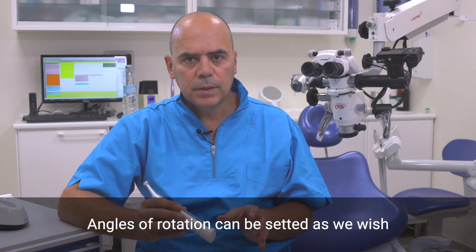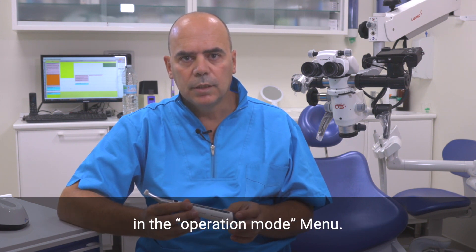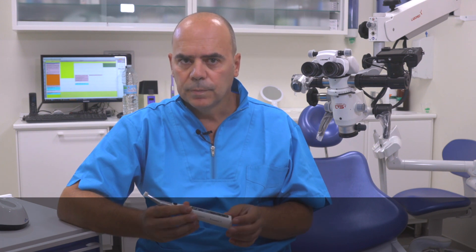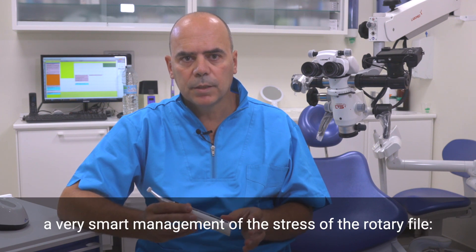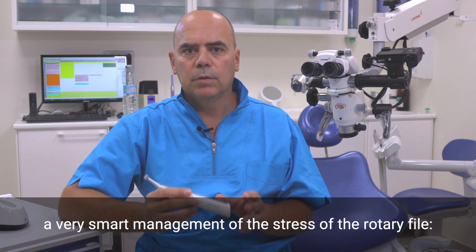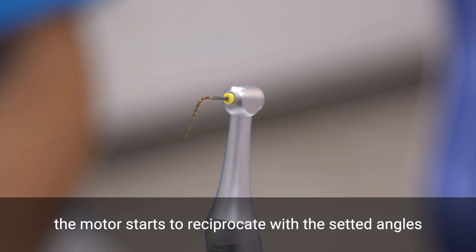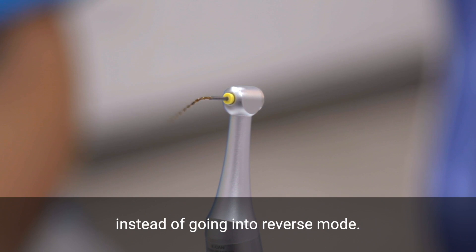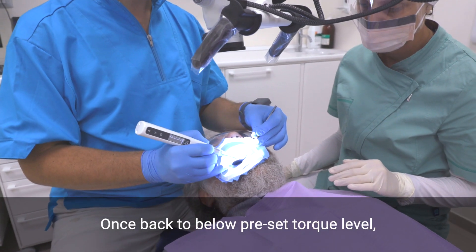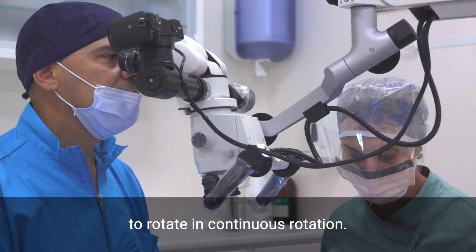Angles of rotation can be set as we wish, even if we choose the adaptive torque control in the operation mode menu. The adaptive torque control mode allows the clinician a very smart management of the stress of the rotary file. Indeed, when the preset torque limit is reached, the motor starts to reciprocate with the set angles to reduce the stress on the rotary file, instead of going into reverse mode. Once back to below the preset torque level, the rotary file will start again to rotate in continuous rotation.